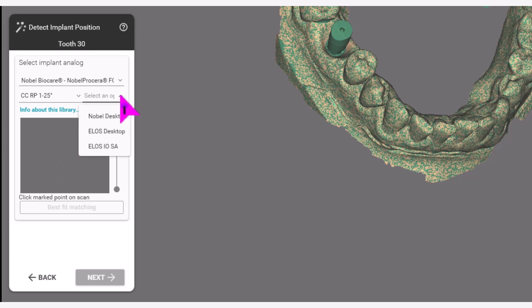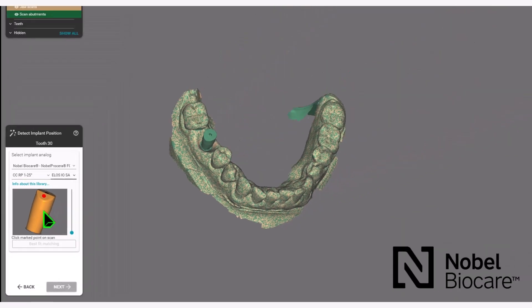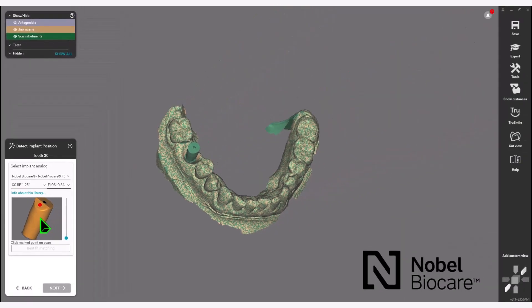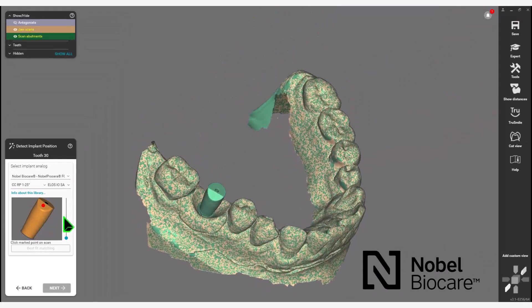Next, select the scan body that was used. Then mark the scan body on the scan data.